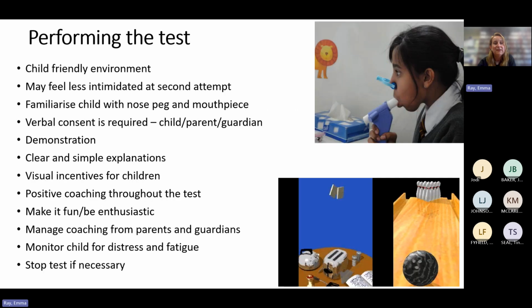So performing the tests, have a think about your environment. It can be quite a nerve-wracking experience for a child to come into a hospital setting or a GP practice. If there's lots of equipment around, could you tidy it up, or could you just make it look a bit nicer, so that they're less intimidated? If they can't do it on the first test, they might benefit from coming back and doing it a second time, so then they've got familiar with the setting.